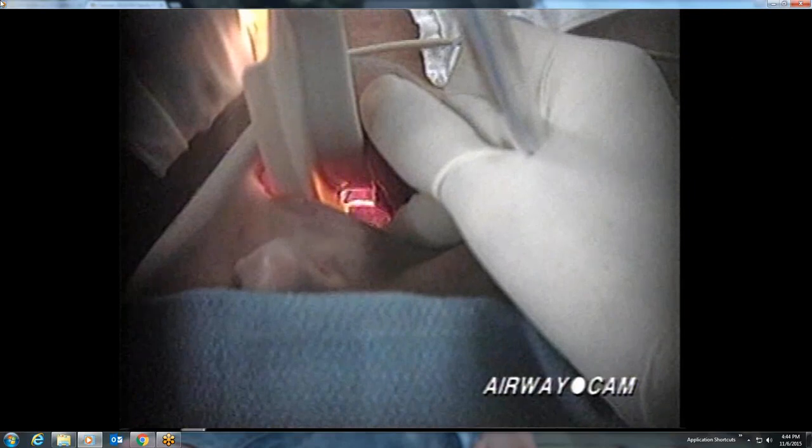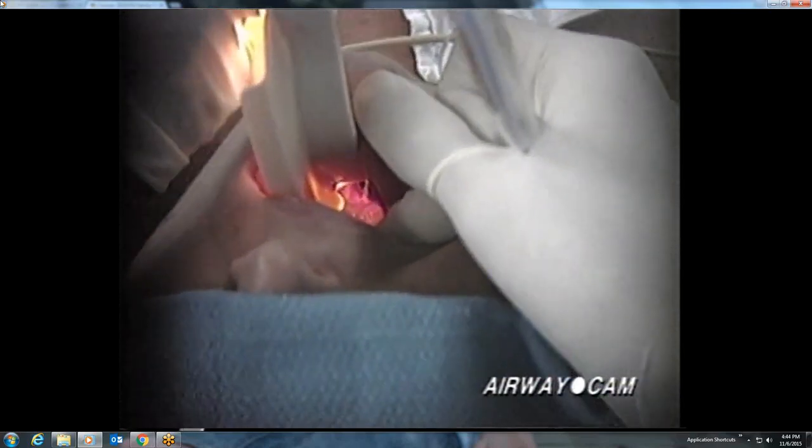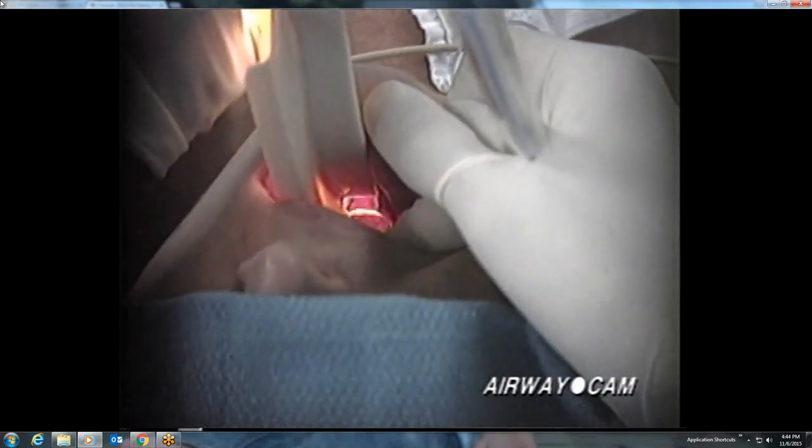Manipulation of the epiglottis with the tip of the curved blade is so important that we will review it again in slow motion. The tip of the curved blade can be used to pick up the epiglottis directly, but it is designed to sit in the vallecula, where the base of the tongue and the epiglottis meet. Firm pressure at the hyoepiglottic ligament causes the epiglottis to flip upward and expose the larynx.